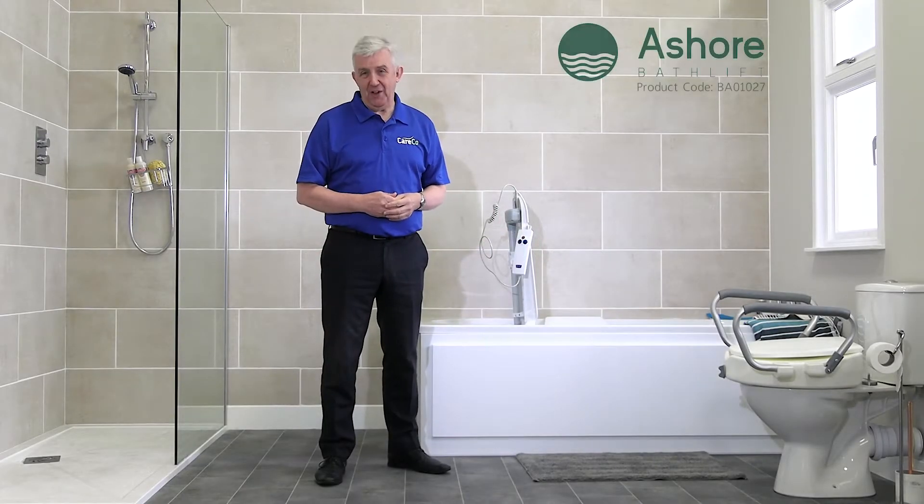Thank you for purchasing the Ashore Bath Lift. We've put together this short video to help you with its assembly and to make sure you get the very most out of your new CareCo product.